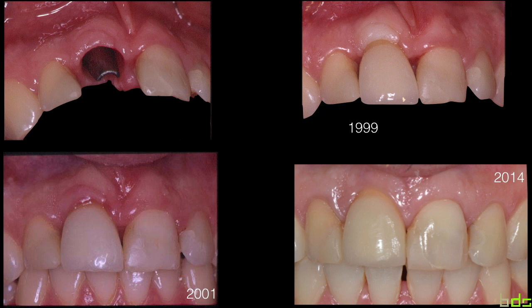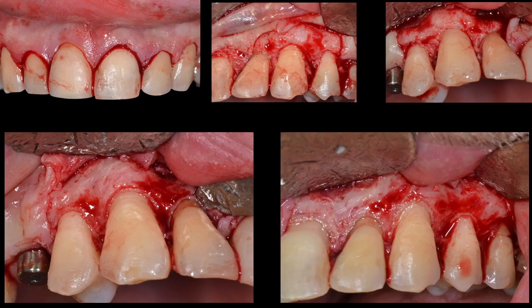This is some 16 years post-implant treatment. Now, the patient came back in 2015, where I inherited the case and placed an implant in the premolar area. He also asked to have some gingival recontouring of the anterior teeth, just to improve the aesthetics a bit. So we agreed on doing a small esthetic crown lengthening without touching, obviously, the implant, and trying to match the gingival levels in a better way.